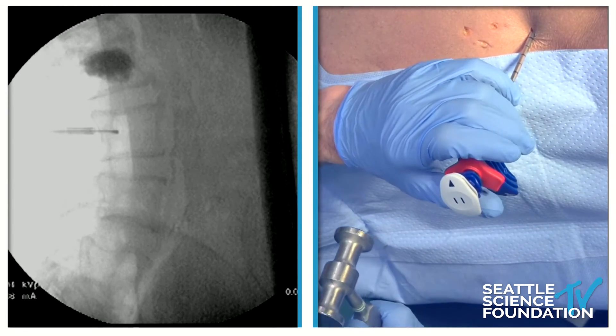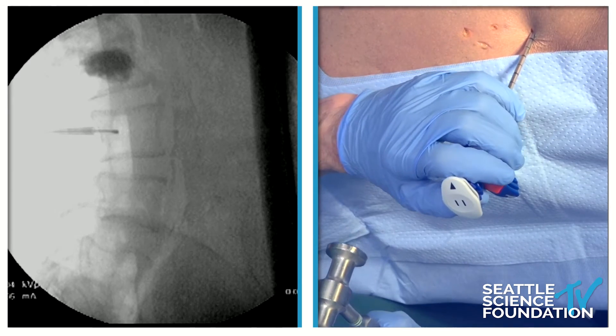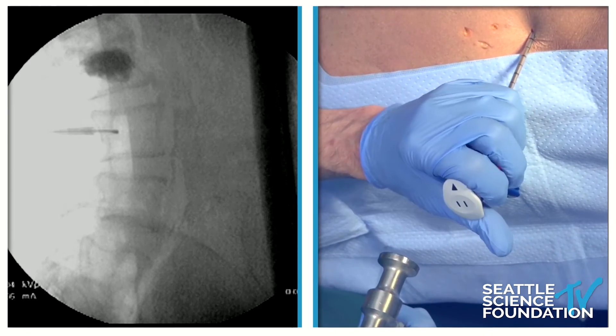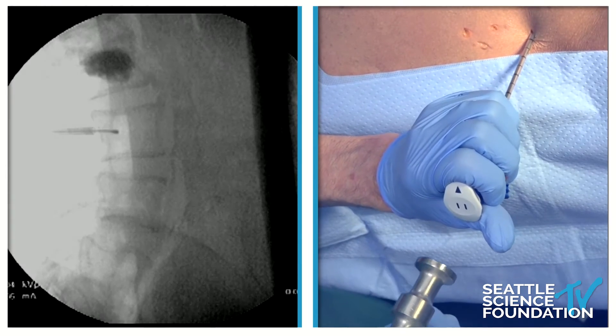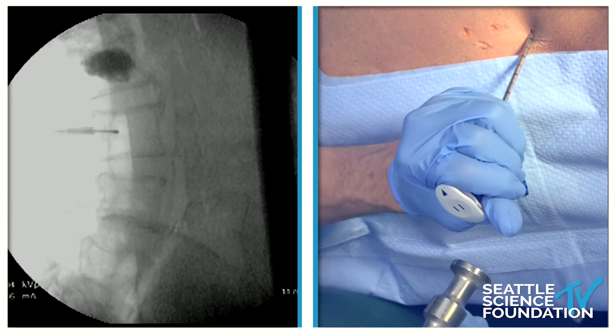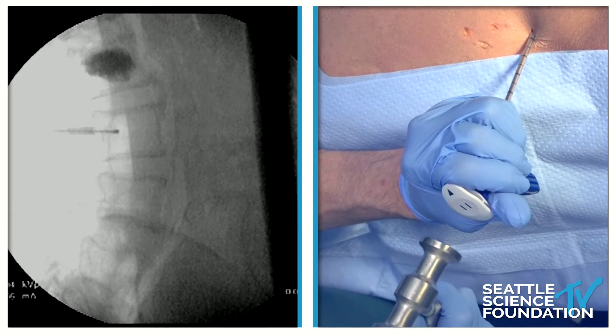It's looking 50% up from bottom to top, and at minimum 40% of the distance from back to front. I'm going to aim this a little bit superior. And if you notice, that spatula is foreshortening — it's getting smaller.